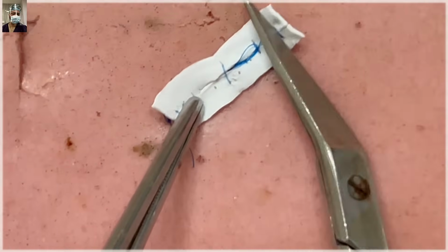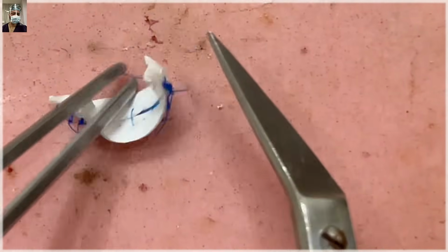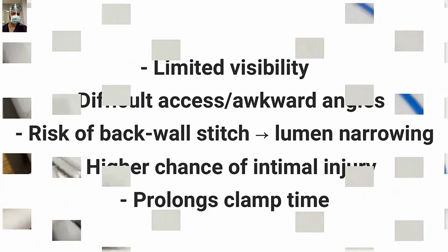The spaces are there because I have not taken all the sutures. Basically, this is a demo video. In real life, you will take sutures at closer spacing.